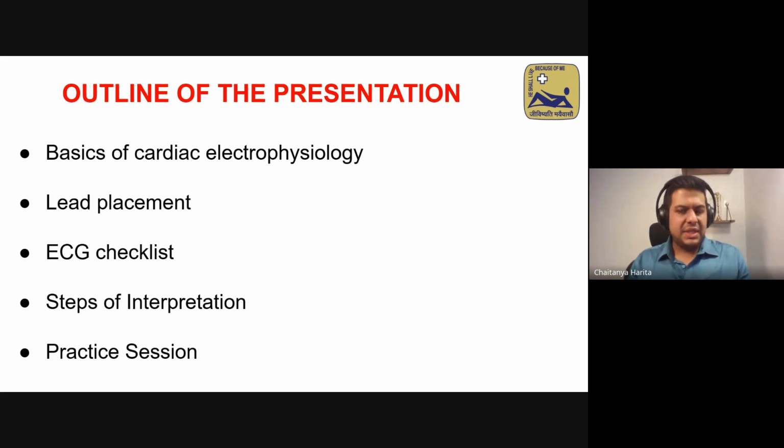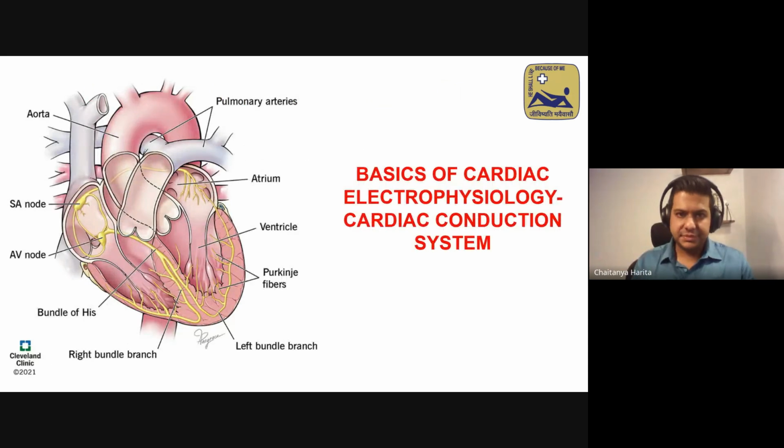The ECG checklist, which I think is the gold standard for any doctor to follow, ensures that you can pick up 90% of all findings. How to interpret an ECG, that's the ECG reading basics, and a practice session to culminate.